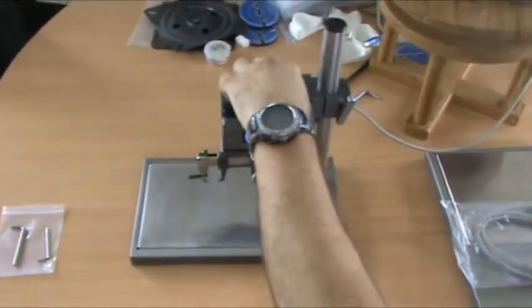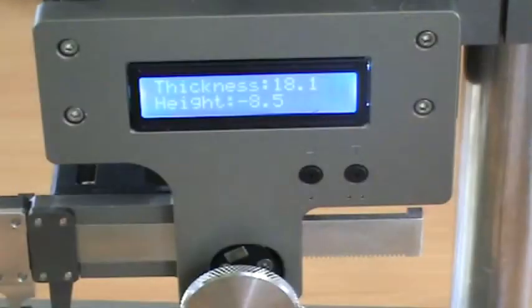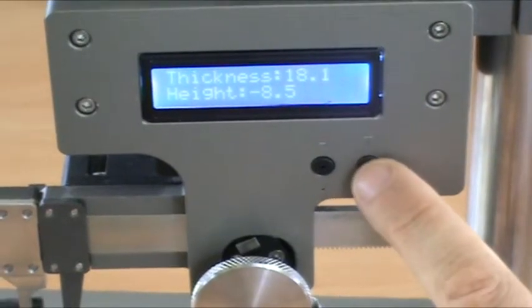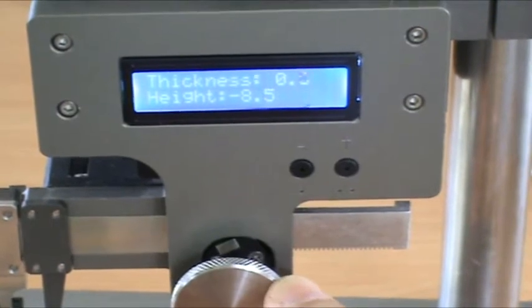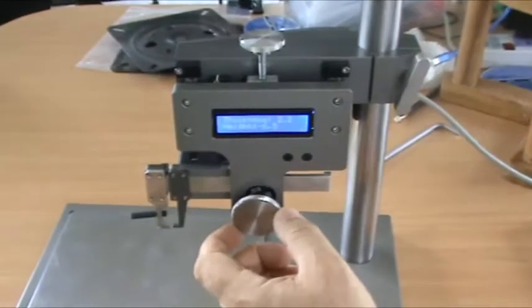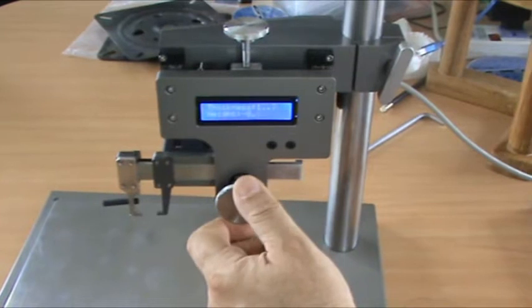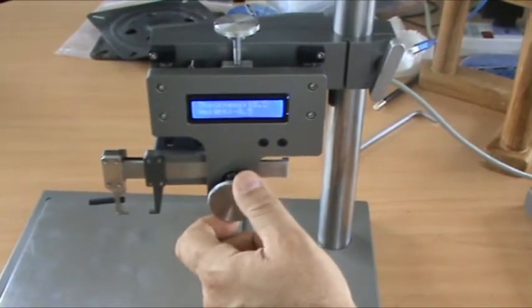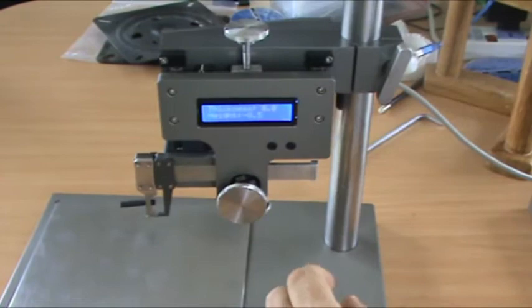The measurements are in 0.1 of a millimetre for both thickness and height. On the front are two buttons, one with an H, one with a T. These buttons serve to zero when we want to measure. So before we measure, we can zero the thickness. Now that is at 0 millimeters. And then as we open it up, it measures the distance from the jaw to the bracket holder. And that's what we need to measure the thickness from the slot of the bracket to the vestibular part of the tooth. Very important for the lingual. Not important for the labial.